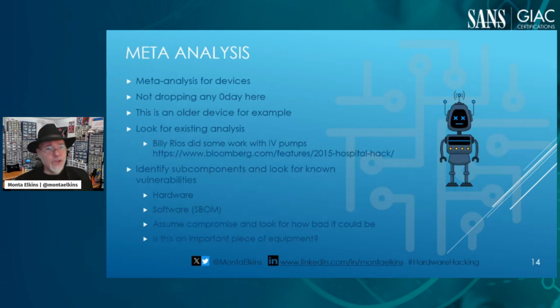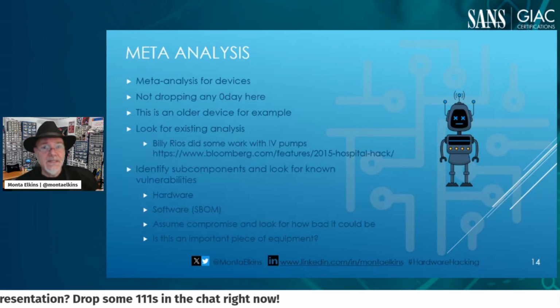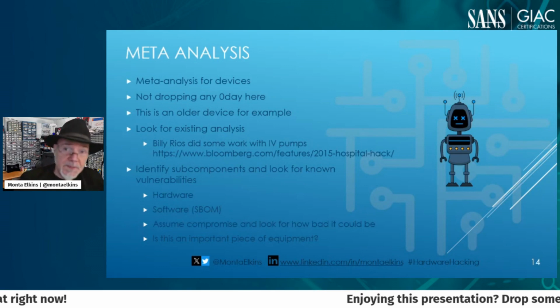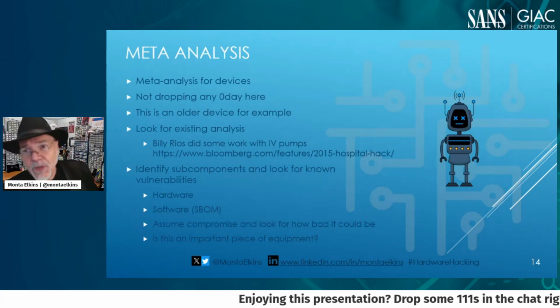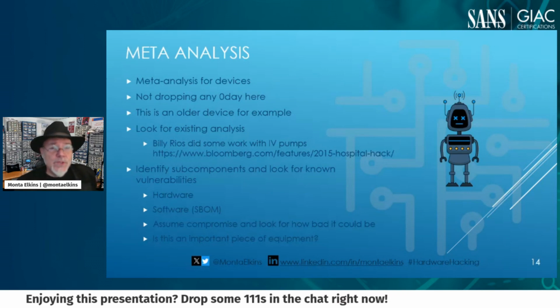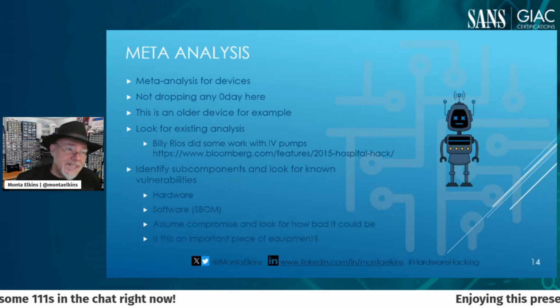So how do we look at some of these devices? And I'll give you a couple of tools and concepts quickly. I'm not going to drop any zero day on this device, right? This is just how we would look at them. One of the things, though, if it is an older device, look for existing analysis. Somebody else might have done some work on it, and there was some other work done on these devices before I took a few of them apart. And then we're going to identify the subcomponents in it and look for vulnerabilities in each of those.